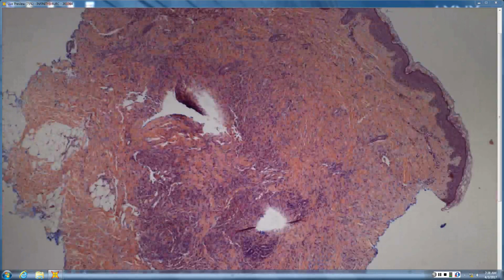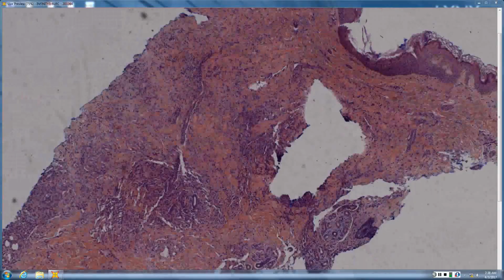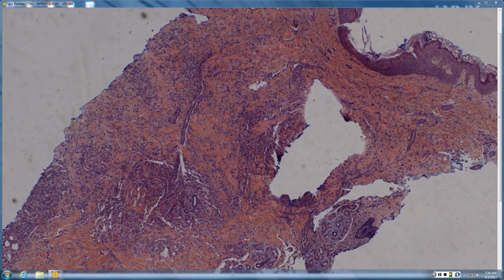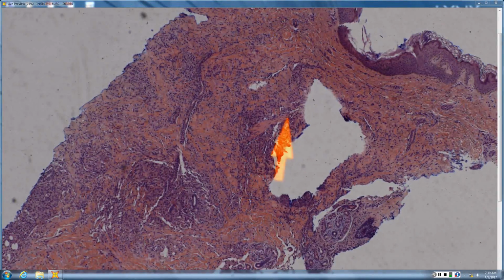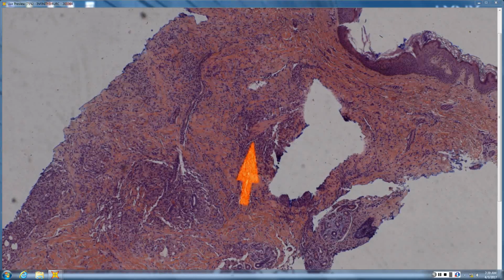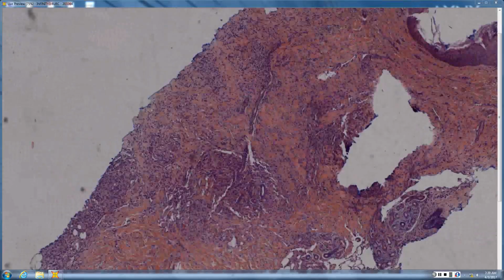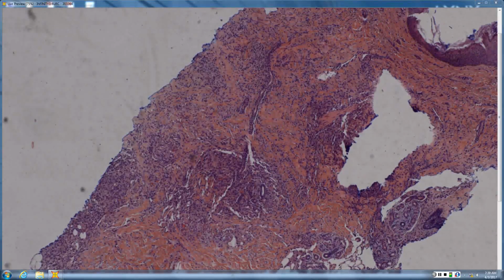So there are small slit-like spaces. Is it diffuse throughout the dermis, or is it centered? Is it patchy? It's patchy. And is it centered around any pre-existing structures? It does look like it's centered around pre-existing vessels. And that would be a pattern typical for KS. Absolutely typical for plaque KS, where you have a busy dermis with slit-like vessels, and it's patchy and centered around pre-existing structures like the eccrine coil, the erector pili. So this absolutely is a dead ringer for plaque KS, except that it is negative for HHV8, and you can see how red the dermis is.